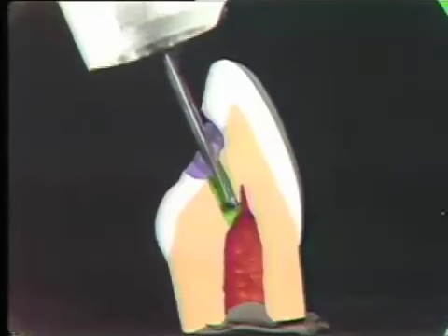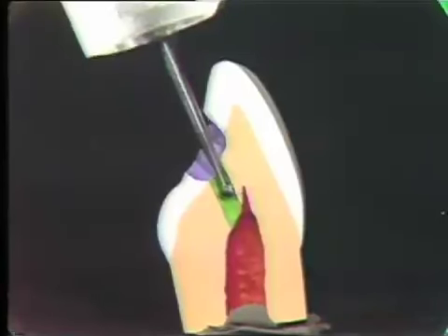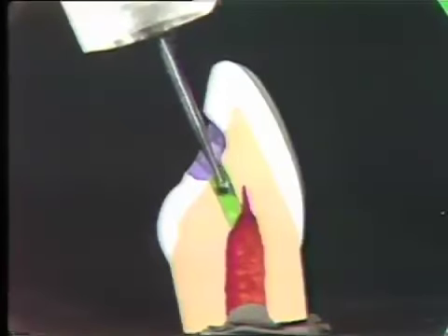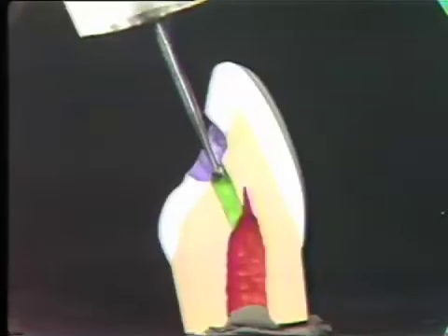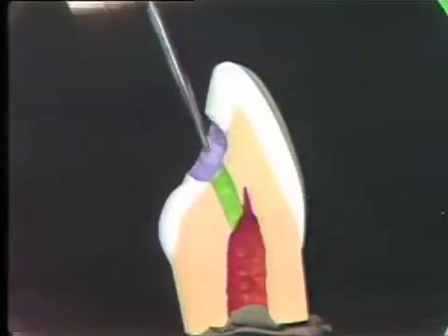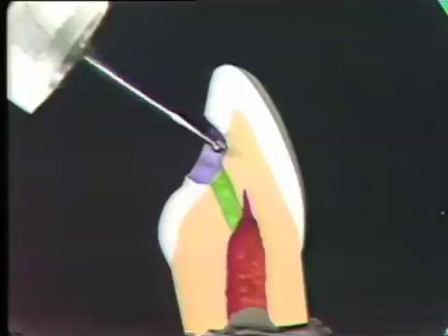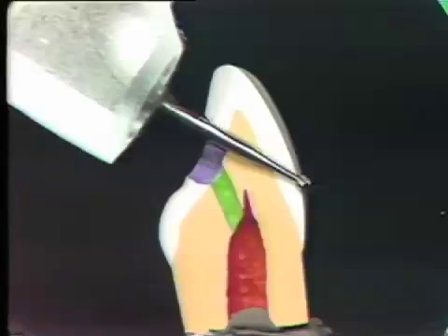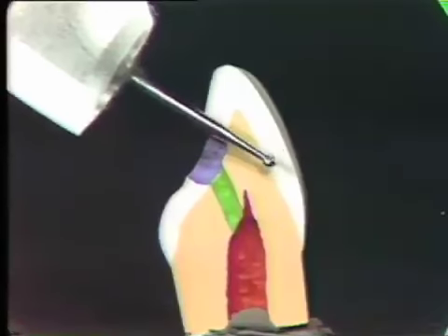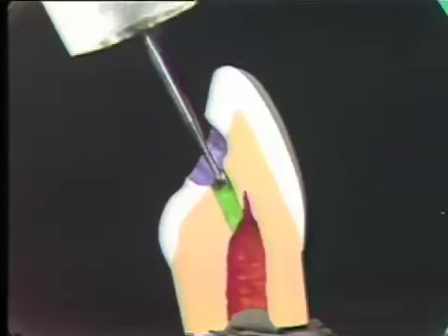Now, if you have the proper angulation in this step, it's almost impossible to miss the pulp chamber. You have to keep the head of the handpiece tucked over the incisal edge of the tooth. There are two ways where people get in trouble in this step. One is to start off in the wrong angulation. They keep it in the same angle that they kept the high speed, and they continue right out, miss the pulp, and go right out the front of the tooth. Patients don't like you drilling holes in their teeth while you're looking for the pulp, so make sure and check your angulation so that you're in the proper long axis of the tooth and go right on down.